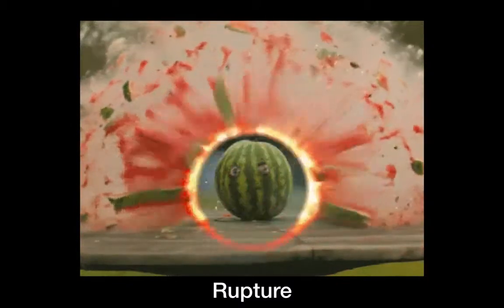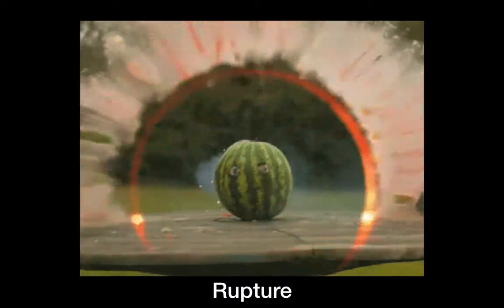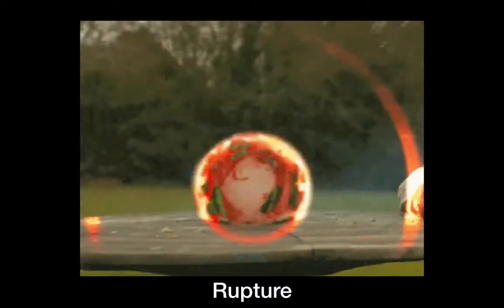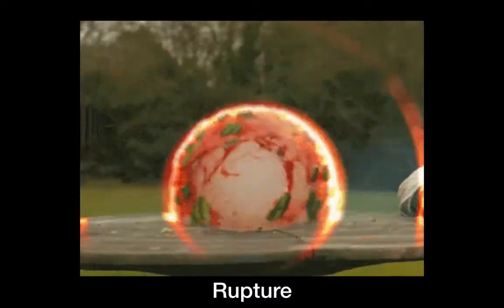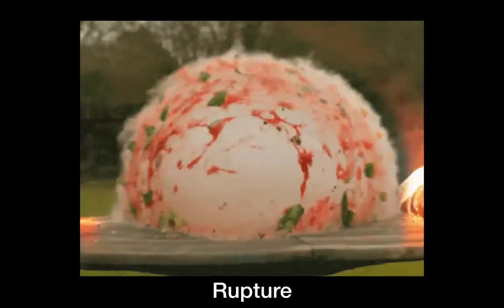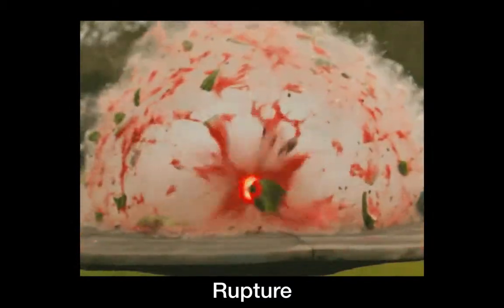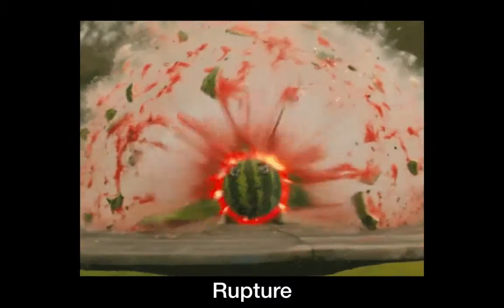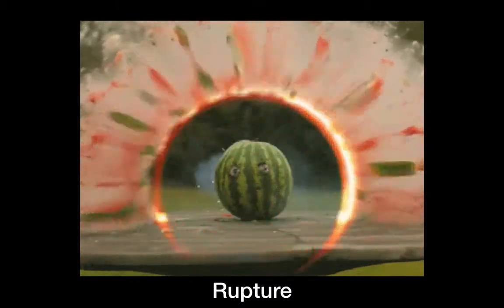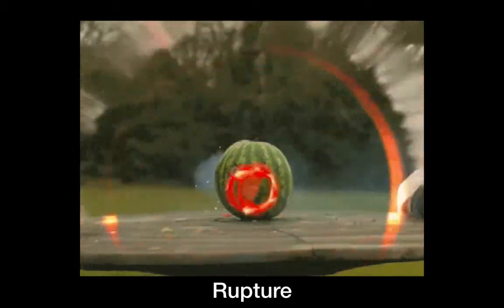We're going to focus on ruptured abdominal aortic aneurysms now that we've seen what a normal aorta looks like. We've had a few examples of AAAs. Now, ruptured AAAs are obviously much more concerning than unruptured AAAs. Not trying to diminish the importance of getting someone the treatment they need if they've got a large unruptured AAA. But the ruptured AAAs are really the time-sensitive ones we want to catch and ones we really want to hustle quickly through our diagnostic and therapeutic algorithms.